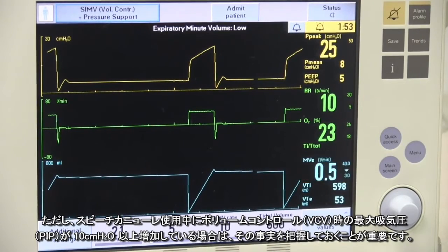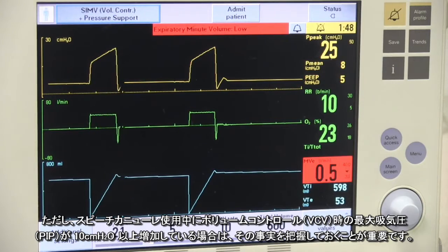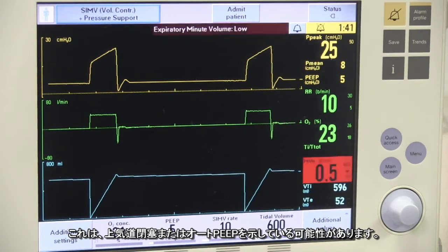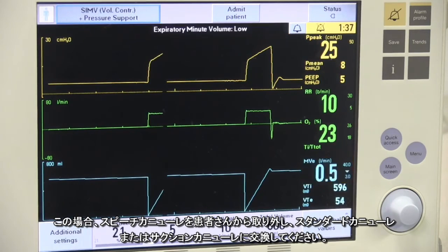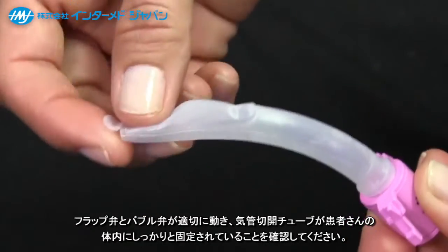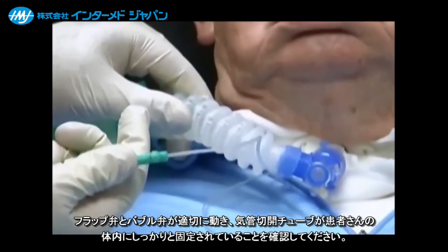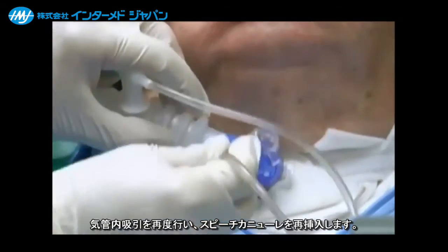It is important to note that if you do see the ventilator registering more than a 10 centimeter of water increase in peak inspiratory pressure in volume control during speech cannula use, this may be indicative of upper airway obstruction or air trapping. In this case, remove the speech cannula from the patient and replace it with a standard or subglottic suctioning cannula. Check that the flap and bubble valves are moving properly and that the tracheostomy tube is well seated within the patient. Suction the patient again and reattempt the speech cannula.